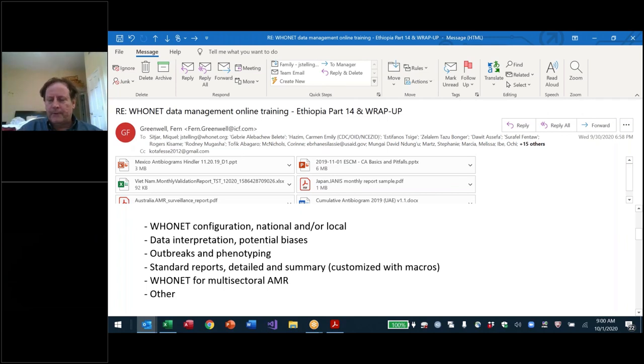Before I comment on that, just on these ideas of reports, keep in mind that in the first 1-2 years of any surveillance program, the focus is really to try to build a strong program, describe the data collection, the quality measures, all of these things. In answer to the questions from your colleagues, where's the epidemiology? Where are the patient level details? Tell them, we're doing this, we're just getting this off the ground. We're focusing on the completeness, data management, laboratory test quality.